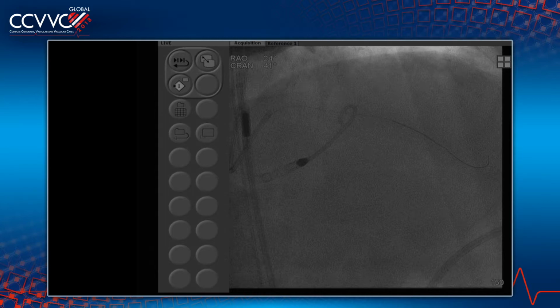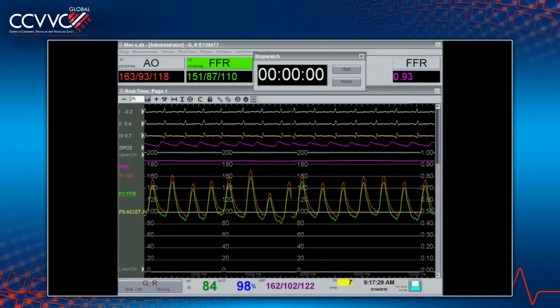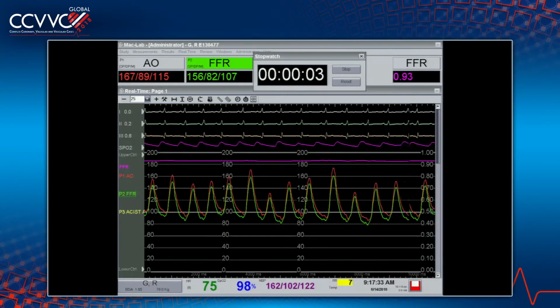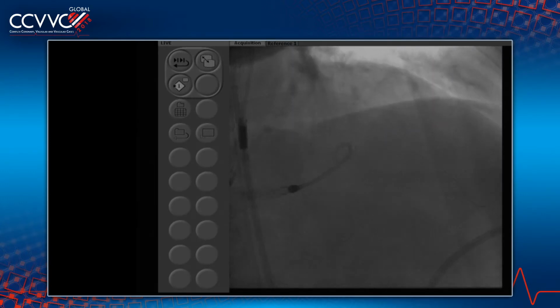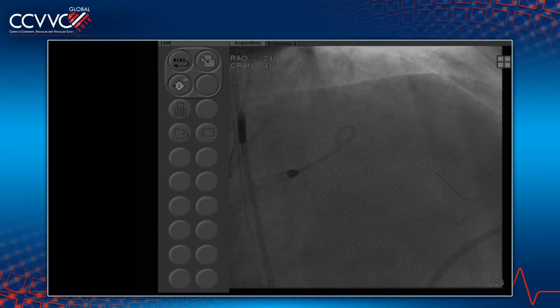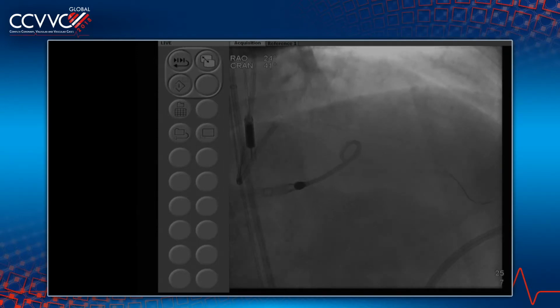All right, start the drug. We are with the resting FFR now. Resting is 0.93. Mark Reisman, you have a comment on the imaging? I think the OCT has been very helpful here, and it looks like it's not very significant. Your other wire has come out. I think that before, everyone was looking at the angiogram, well, this looks good, why do we even have to image it?